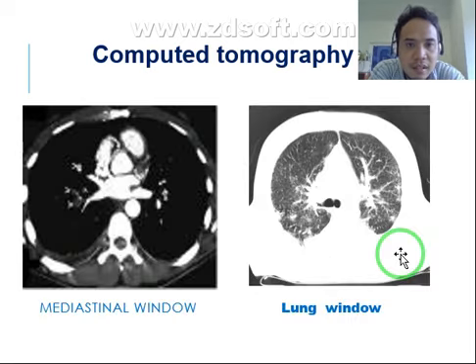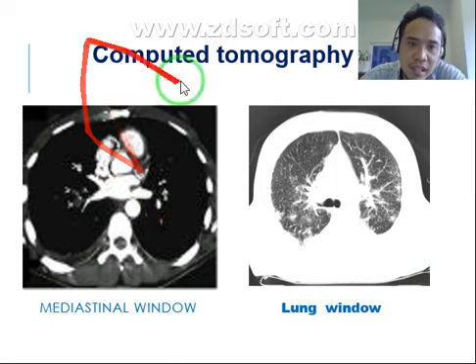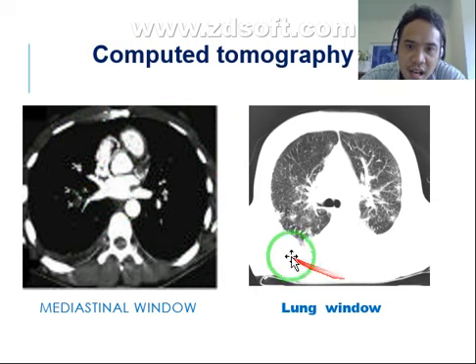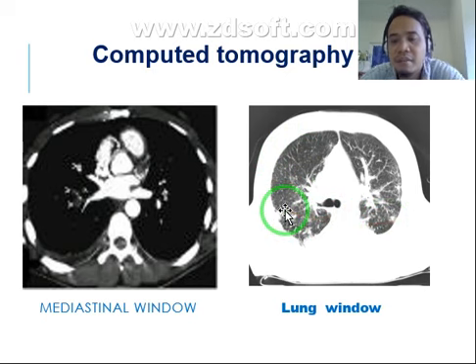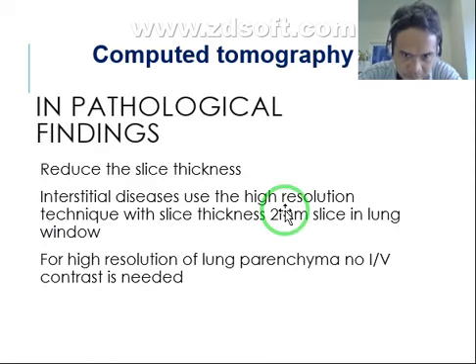Okay, so this is the image of the mediastinal window. As you can see, sa cardiac or sa atong heart, makitaan kayo siya, highly visualized ang mga pulmonary vasculatures. But sa lung window, makita jud ang mga tiny details like the terminal pulmonary vasculatures and mga infiltrates, maklaro nimo siya sa lung window. Okay? So that's the advantage of this windowing setting.